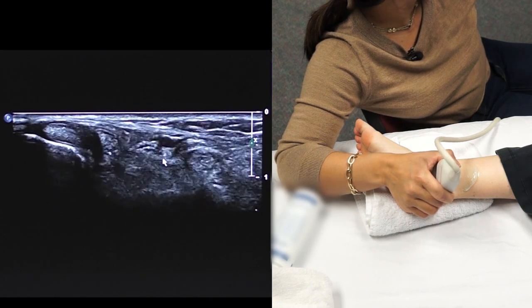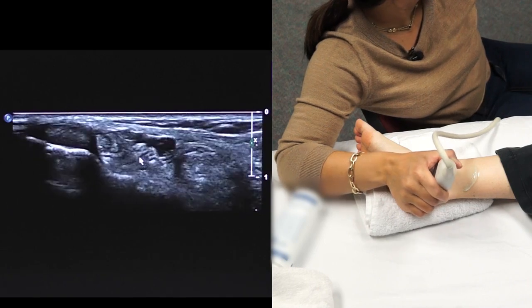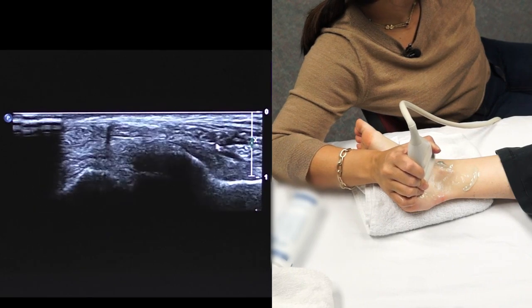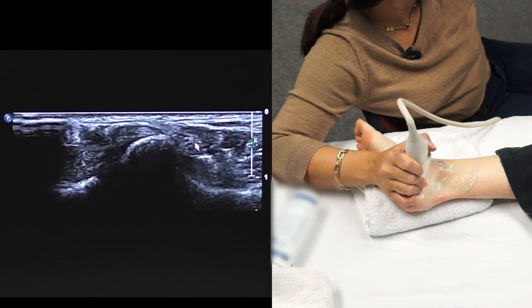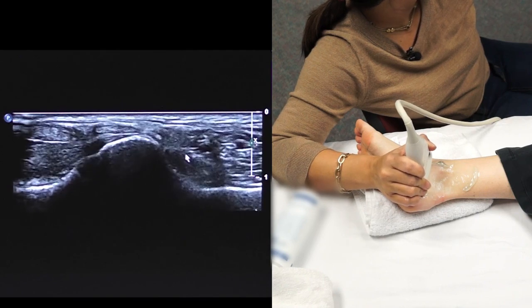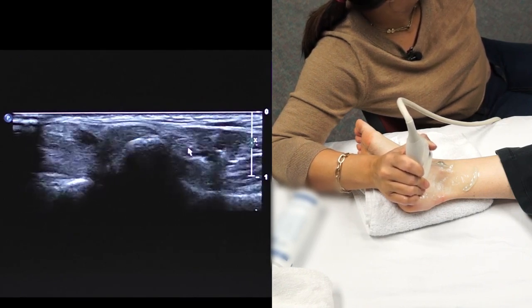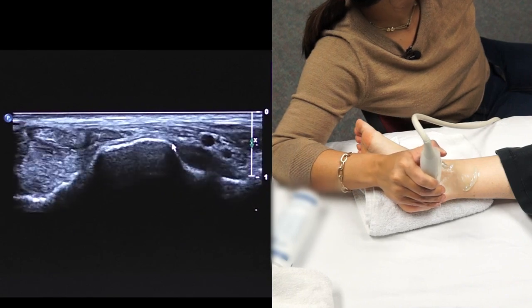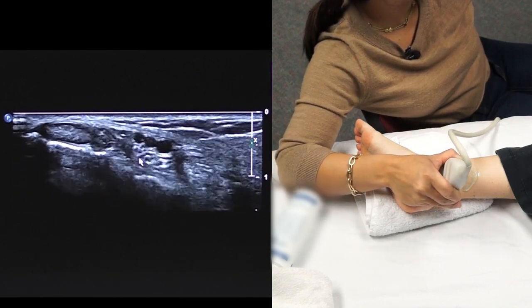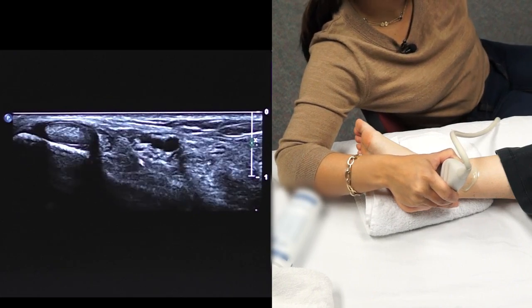And you can see as part of this bundle is the tibial nerve. So every now and then when you're looking for pathology that could be impinging on the tibial nerve, especially distally at the level of the tarsal tunnel down here, you're keeping the tibial nerve in view. This is where you might want to look for ganglia or other masses or structures that may be impinging on the tibial nerve. And oftentimes when there is a nerve entrapment, before you even see a narrowing of the nerve, you may see an abnormal appearance to the nerve.